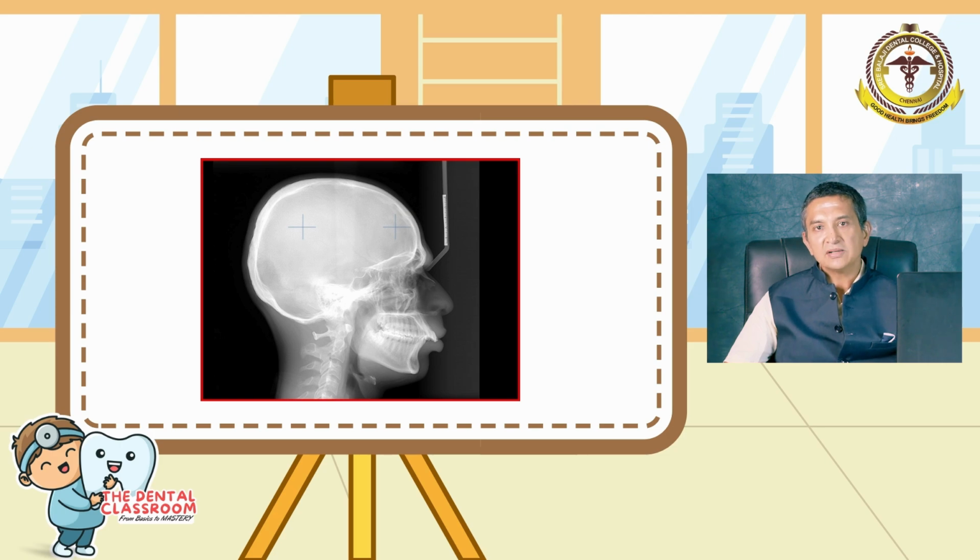The important rule in putting these cross marks is that they should be on a very clear area, that is, on the white area. Normally we put 2 on the head region, the forehead region, and 1 in the cervical vertebra region, preferably not masking the relevant cervical vertebra, which is C3 or C4 as the case may be. Once we put these crosshairs, we are sure the acetate tracing sheet will not slide, and in case it slides, you can always reorient it back to the original position.